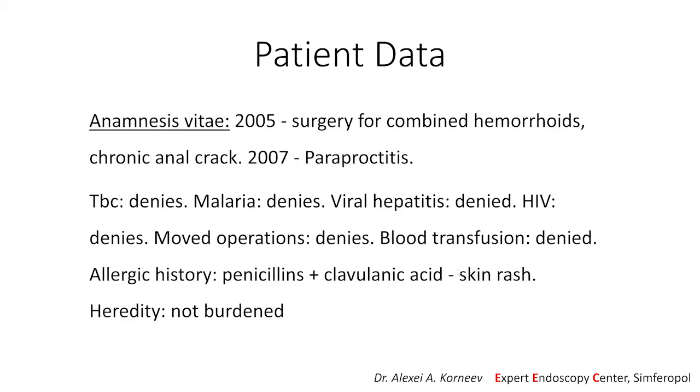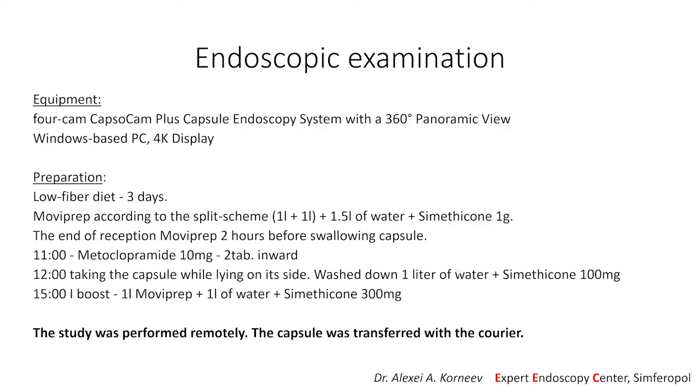I listened to the patient, gave her detailed instructions for preparation, issued the capsule, and filled out the necessary documents. The patient was prepared at home on her own, according to the written instructions issued to her. When it came time to swallow the capsule, we were in telephone contact. Everything went smoothly, and after 3 days, I received the capsule by courier.